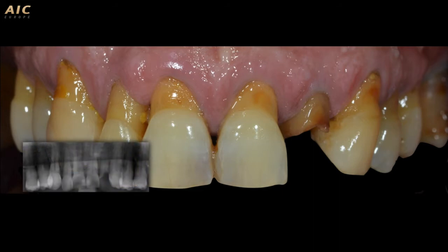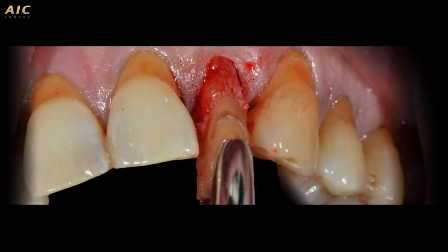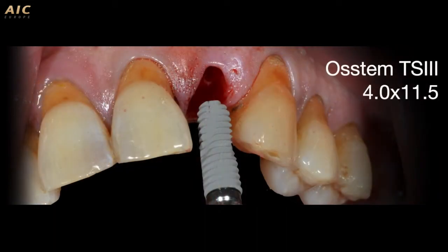This is the X-ray of the fractured tooth, and we chose to extract it in an atraumatic way and replace the root support of this tooth with an Osstem TS3. This is the diameter, 4 millimeters. This is the length, 11.5.